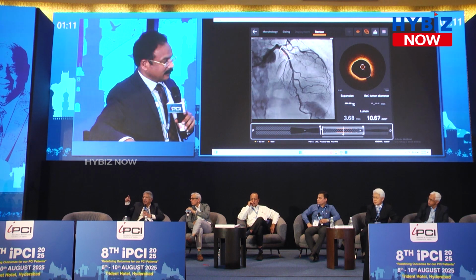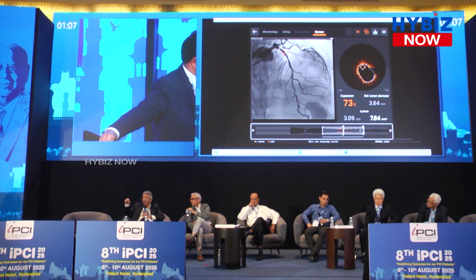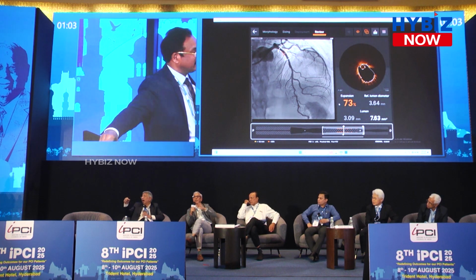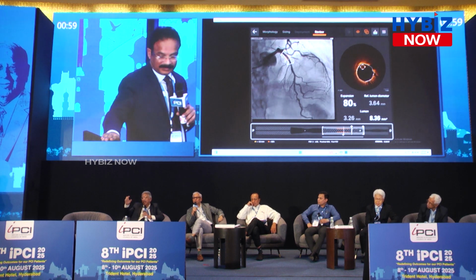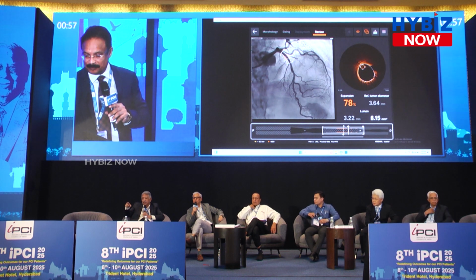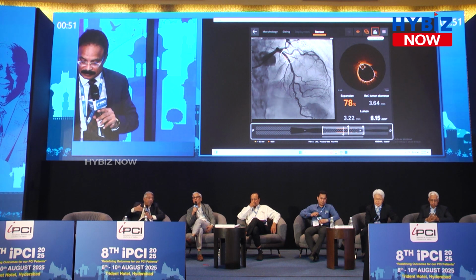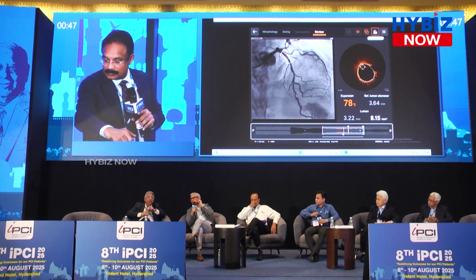But again here, see, you used a 3.5. Actually, you must get how many millimeter square? Around 9.1, because a 3.5 should give you a 9.1 millimeter square. But you're reaching only 7.5. And obviously, the expansion is less. So if you go by the absolute criterion, you've done a good job. But if you go by the relative criterion, you've done a bad job.